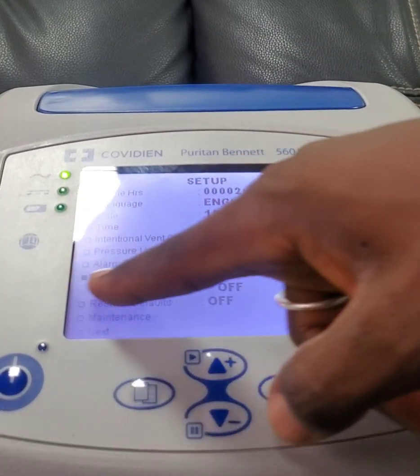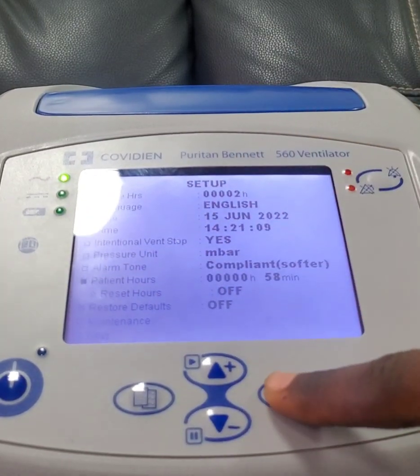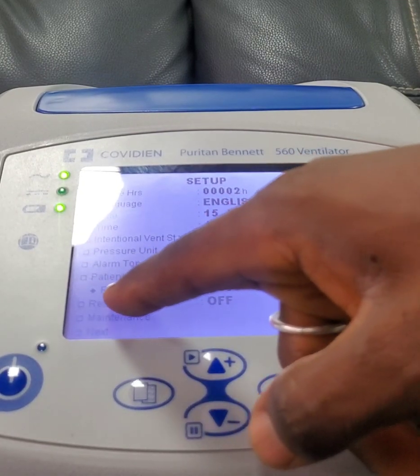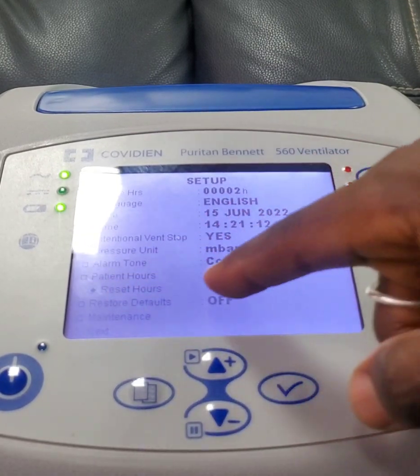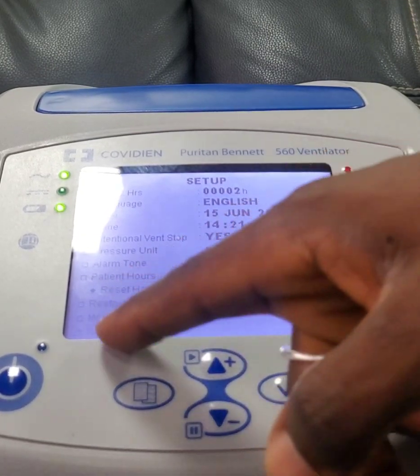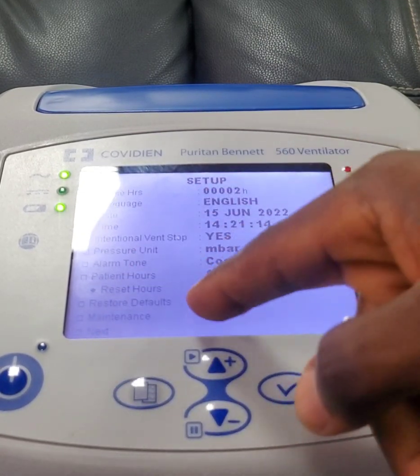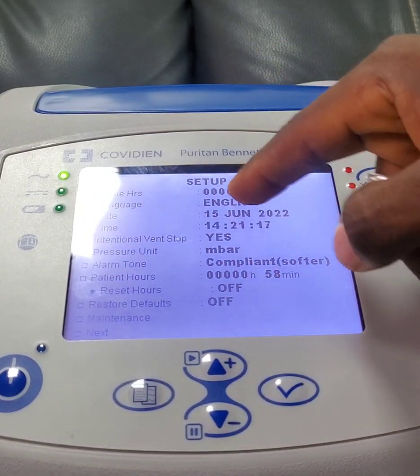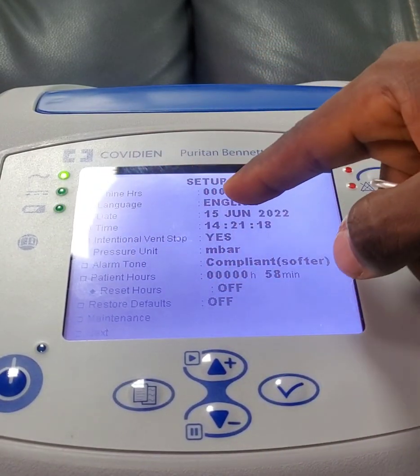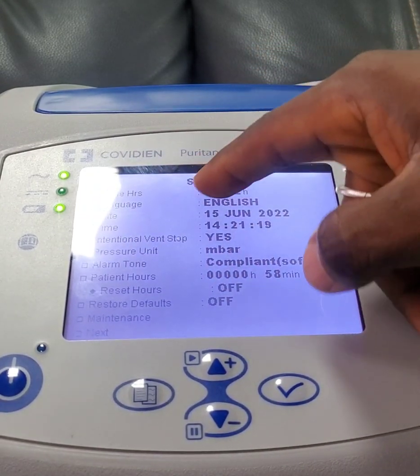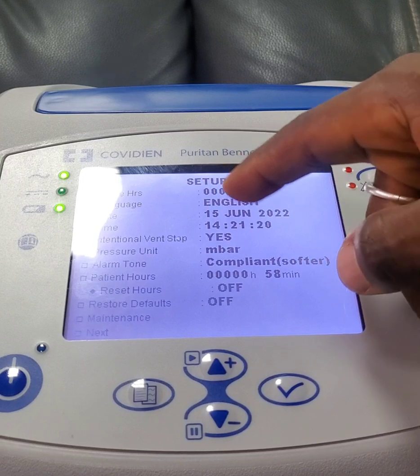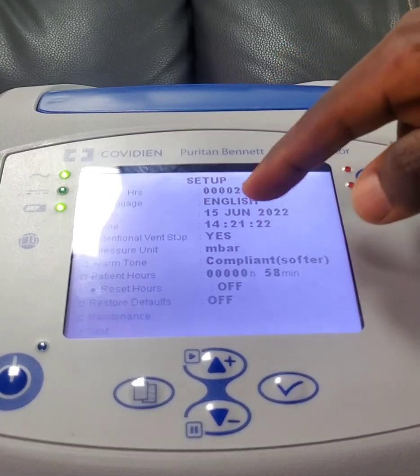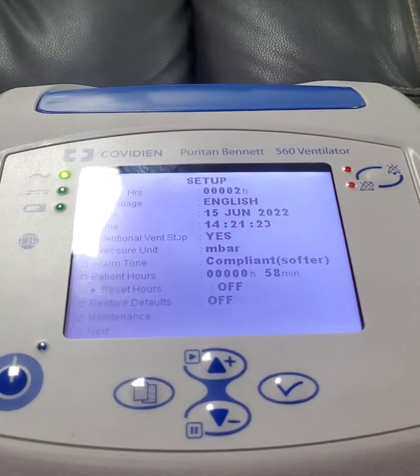This 'patient hours' shows the number of hours this device has been in use on a patient. You can choose to reset the patient hours. However, the machine hours you cannot reset — the only way it can be reset is when the board is being changed.